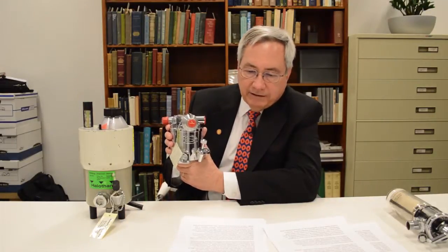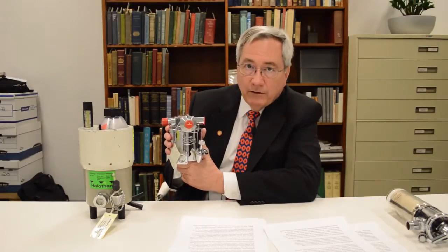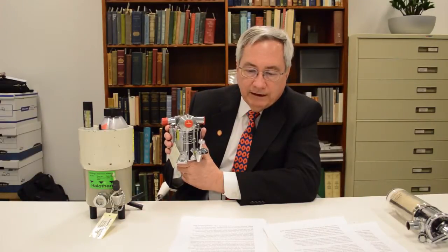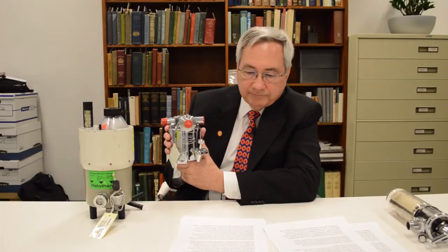So the Fluotec delivered a more predictable concentration of anesthetic agent, specifically halothane, as compared to the Ohio No. 8. This improved control over the concentration of inhaled anesthetic was very important to the safe delivery of halothane.